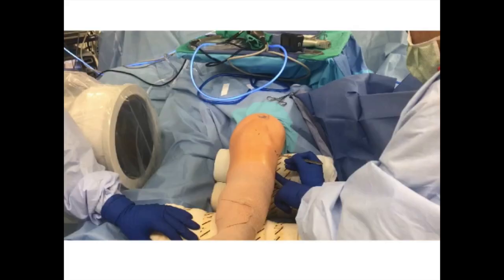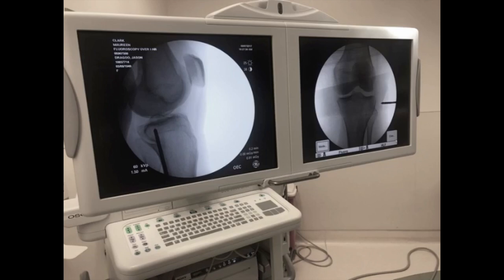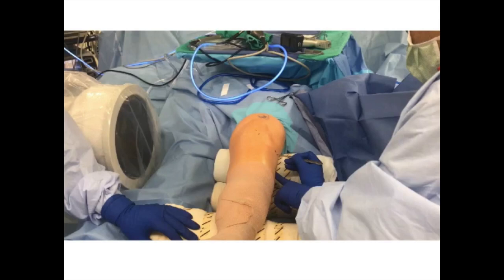This demonstrates the technical setup to inject bone marrow aspirate concentrate into the tibial plateau of the patient's left leg. The patient is supine and a radiolucent bump is placed under the lower leg to elevate the extremity and allow for optimal intraoperative imaging. For the decompression route, ultrasound or fluoroscopy can be used to make skin markings representing the straight line route to the bone marrow lesion.